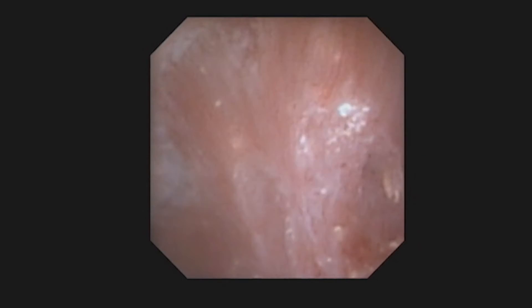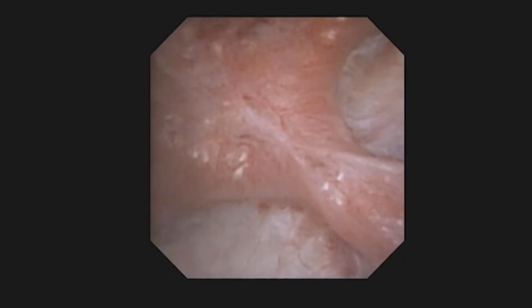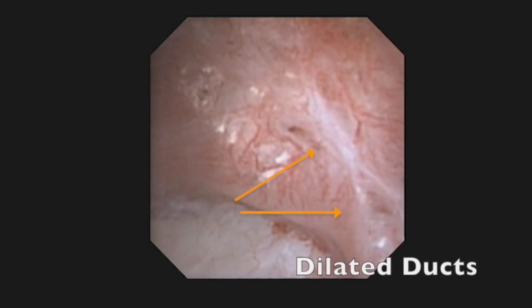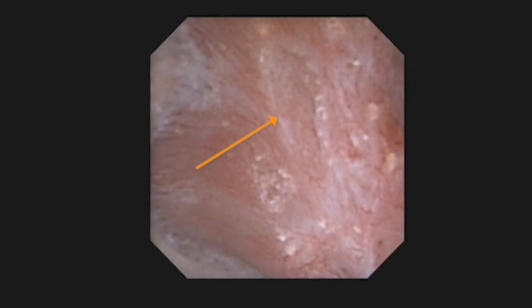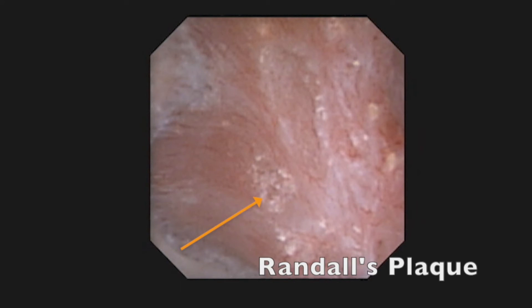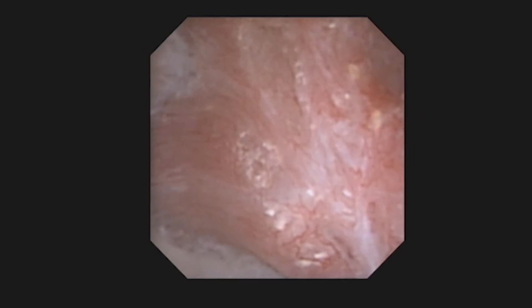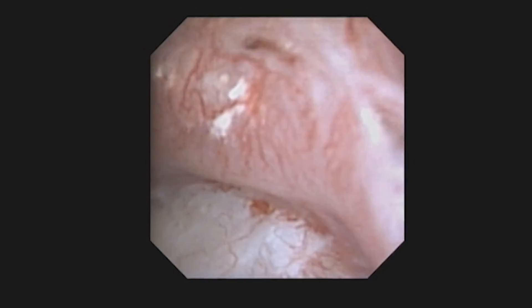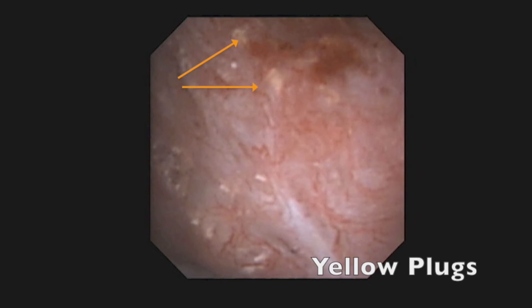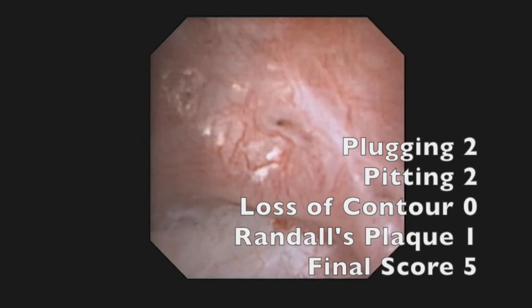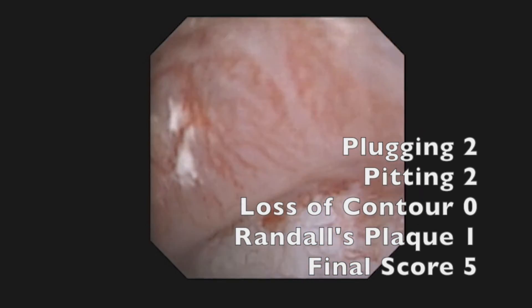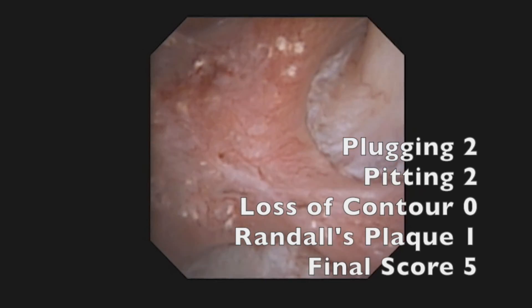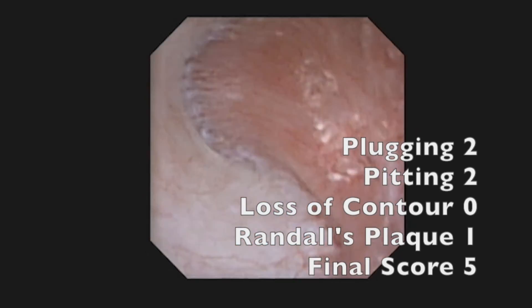In this reference example, a compound papilla can be seen. There are two dilated ducts designated by the arrows. There are a number of superficial pits within the papilla, and there is evidence of scattered Randall's plaque. Several ductal plugs can be seen in the papilla as well. The final papillary score is 5: 2 for plugging, 2 for pitting, 0 for loss of contour, and 1 for the amount of Randall's plaque.